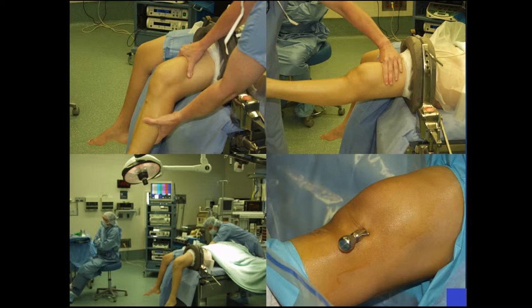This is her exam under anesthesia, putting the arthroscope in laterally. You can see what a huge effusion she has. I like to milk the effusion down to better quantify it. So she's had a huge effusion for quite some time. With these, sometimes we have to put the leg holder a little more superior because we have to make accessory portals to do the complete synovectomy.